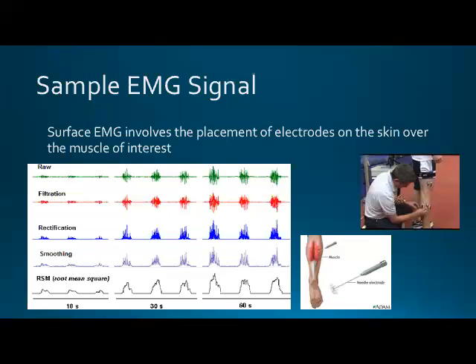So once you have everything cleared out, then you can have the subject start doing some muscle contraction. So this would be contract, relax, contract, relax, contract, relax. You'll notice, at least in this example, that we have some smaller bursts, and as time goes on, you can see that the amplitude of those bursts increases over time. Can everybody see that? So the bursts are getting a little bit darker. So the dark blobs in the middle are getting more solid in color, and they're getting a little bit wider. So this signal is showing you a representation of both the amplitude and the frequency of the EMG.